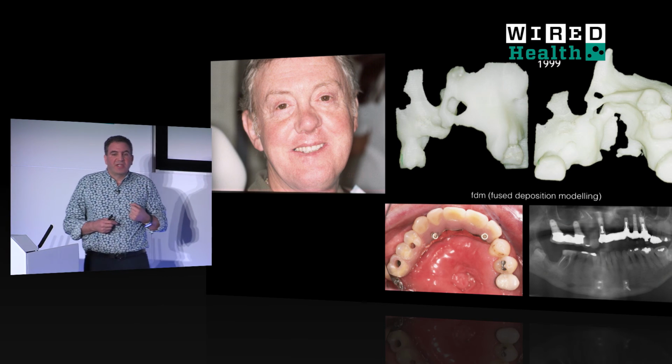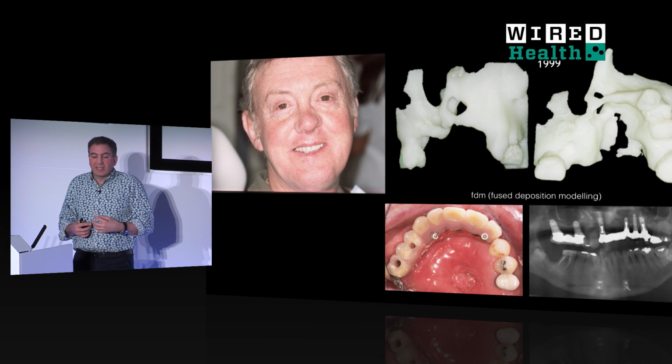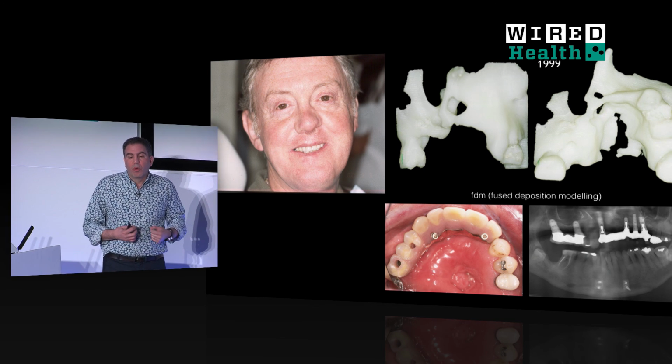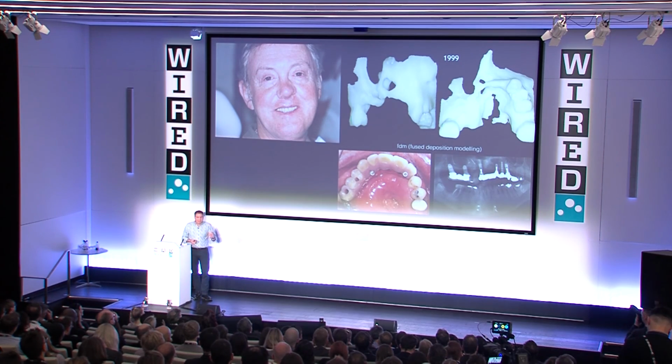So this is one of the first patients I looked after where 3D printing changed everything. Because this is a chap who had a cleft lip and palate, most of the front of his jaw was missing, and he was told that no one could do anything for him. We were able to model his jaw using the fairly crude 3D printers that were available at the time. And by studying it, by paying careful attention to the defect, by actually trying out surgery, we were able to carry out dental implant treatments and reconstruct the jaw and bring him back to a far better quality of life than he experienced before.